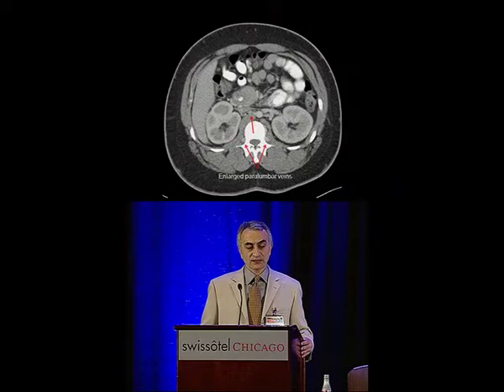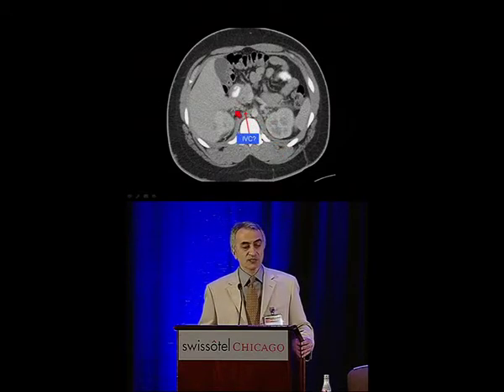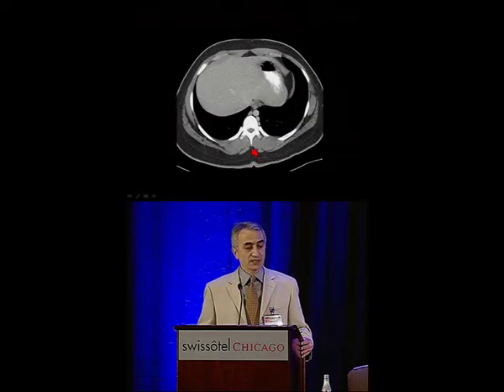And a little bit higher up, you can see these large paralumbar plexuses coming, that there is a chronic process going on over here. And in this case, here's the expected position of the IVC. It's just not there, nothing there. And we're at the level of the kidneys, just above the renal veins. And large collaterals, this one into the portal system, and there were some into the azygous and hemiazygous system going up. And up there, there's just no IVC. Okay? So suprarenal IVC, non-existent.